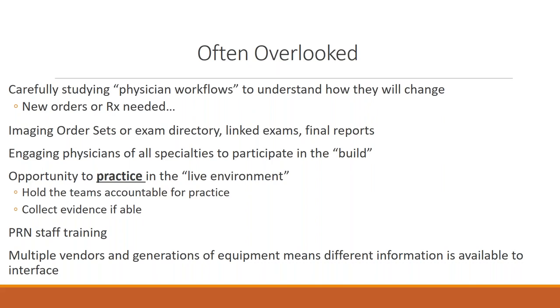One of the things that I stress when we do our go-lives is to make sure that we do a parallel workflow without turning the system on. It's a test soft live, we call it, so that they do the system in the real environment and they're doing the new system coming up in parallel. It's a little extra work for the techs. We do a handful of studies each day, but it shows where the breakdowns are.